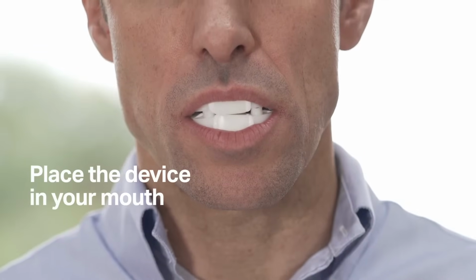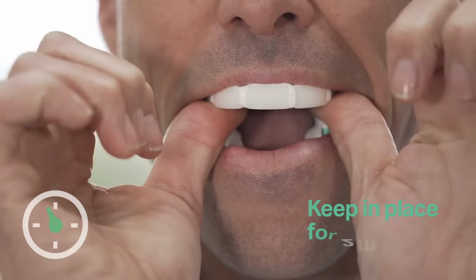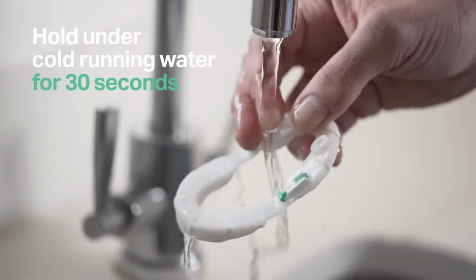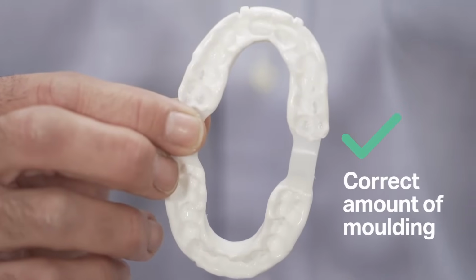Place the device in your mouth with the blocks on your lower teeth. Bite down firmly. Use your fingers to keep it in place for 2 minutes. Remove the device from your mouth and hold it under cold running water for 30 seconds. This will set the moulding.